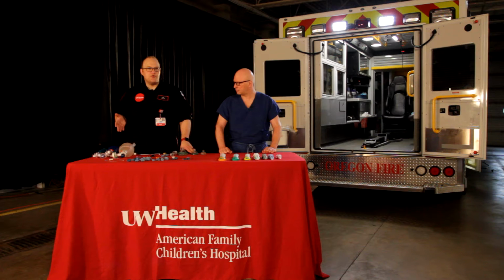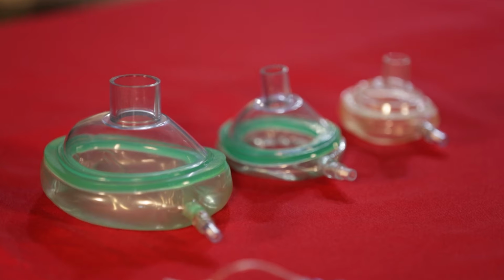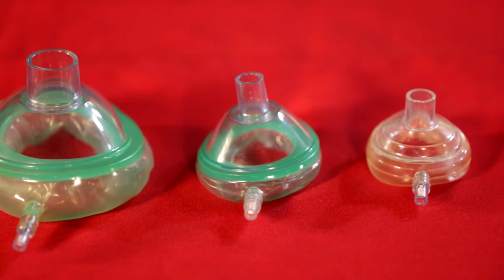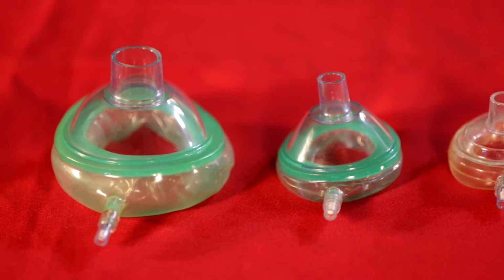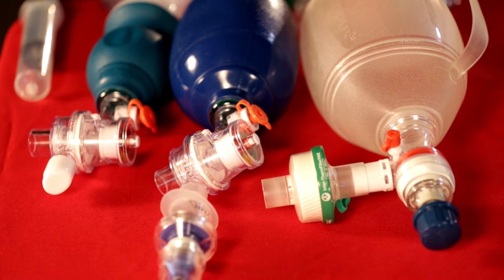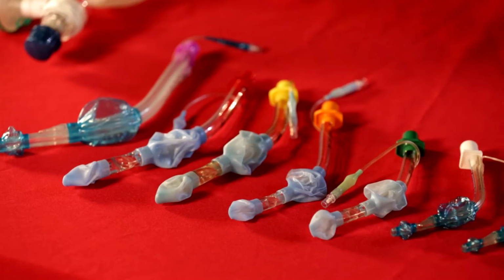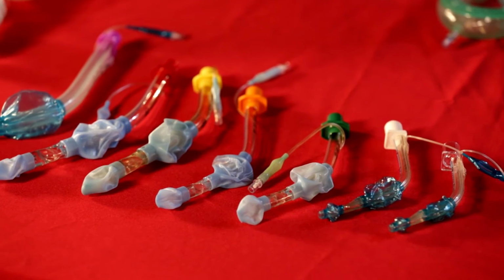The first thing you're going to want to do is make sure that you have the properly sized equipment. We have obviously a range of bag mask ventilation devices, from the very small up into the larger adult size. With pediatrics, a lot of times we have trouble sizing, so you want to have a variety of all the equipment you have, from small to large. A good rule of thumb is figure out what size you think you need, and then go one size smaller and one size larger, and have a 3-part plan.